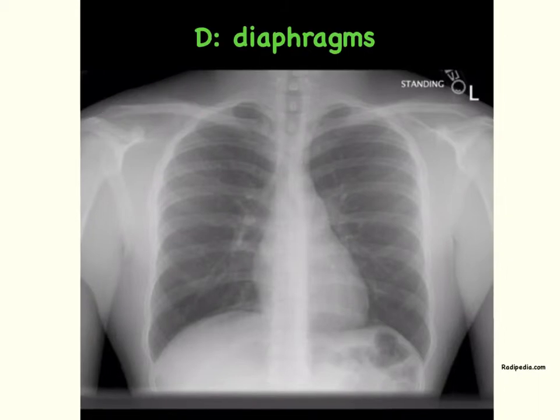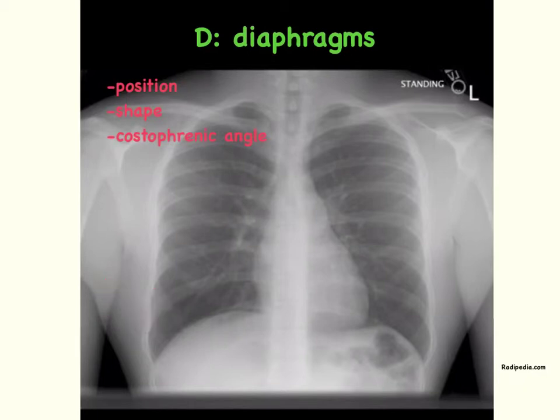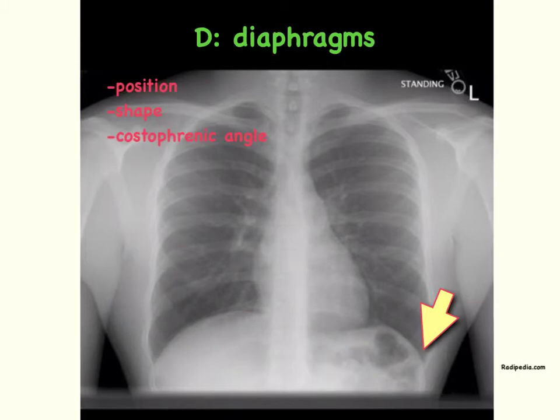D is for diaphragm. When evaluating the diaphragm, you need to evaluate the position — the right is usually slightly higher than the left due to the liver — and the shape. The diaphragms will be flat in a hyperinflated state, such as in an asthmatic or an adult with COPD. It's also important to evaluate the costophrenic angles, which should be sharp. A blunted costophrenic angle gives you concern for a pleural effusion.